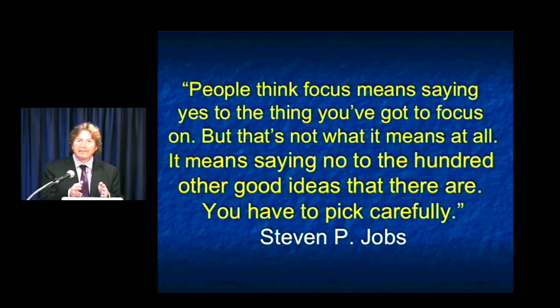Steve Jobs mentioned and always was clear about focus. We need to focus in CT on doing things right, preparing the patients for the study, acquiring the studies correctly, interpreting the studies correctly, delivering the right information to the referring physician. We need to be 360 involved, doing things perfectly, successfully, all of the time. It's a challenge, it's hard, but it's something we should strive to do. And with that, I thank you for your attention.